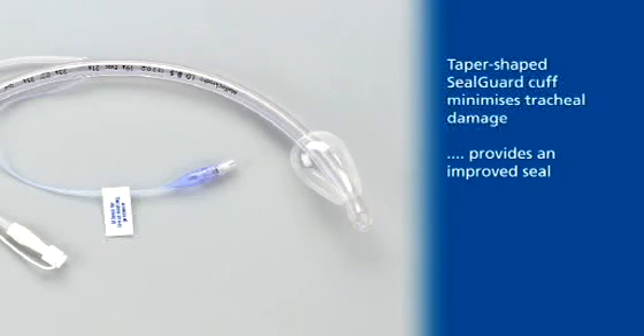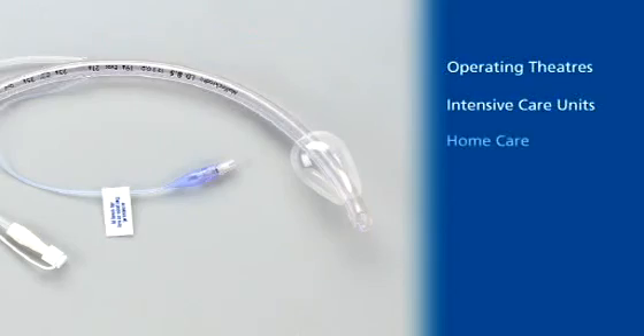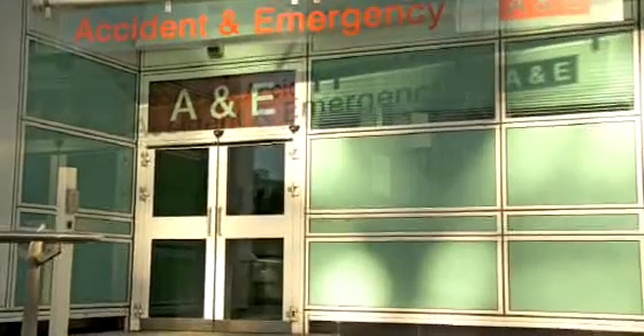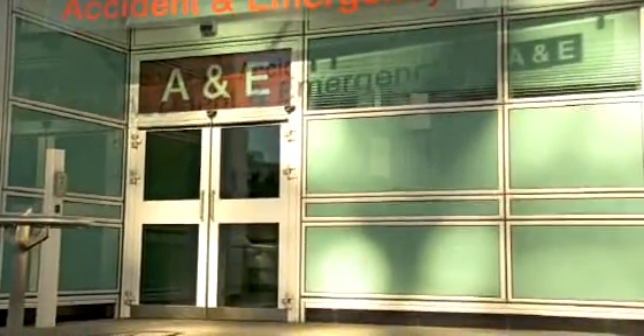SealGuard can be used in a variety of environments, notably in operating theatres, intensive care departments, and even in home care. In this example, we will see intubation of the SealGuard endotracheal tube set in a typical accident and emergency department.